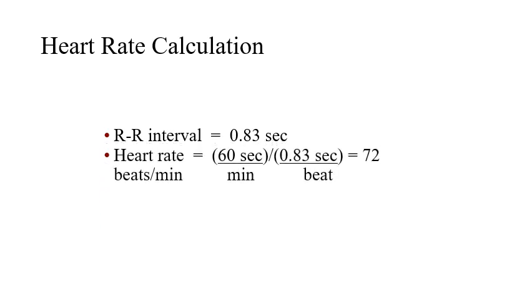One of the main things that we can learn from an ECG record or cardiograph is to measure the heart rate. We can measure the distance between the R's, or take the RR interval, the distance between two R waves.